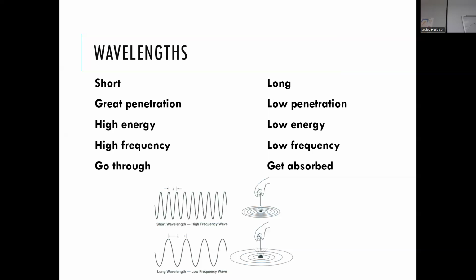Yeah, and what we want is we want them to get as far through and make it to the sensor. However, we absolutely know that they don't all get to the sensor, and that's why we have the grays, the opaque, radiolucent grays. And so it doesn't make sense for them all to get to the sensor, but we want them all to do the best job they possibly can, because it actually makes the image clearer and better, like ultimately what you were talking about. So when they all do their best job, then the picture looks better.